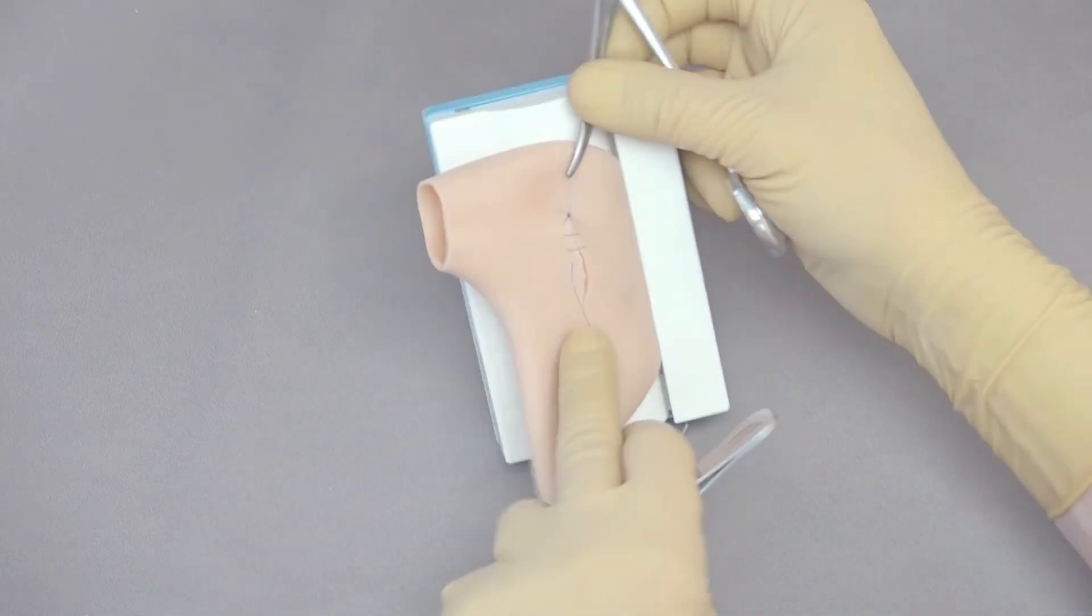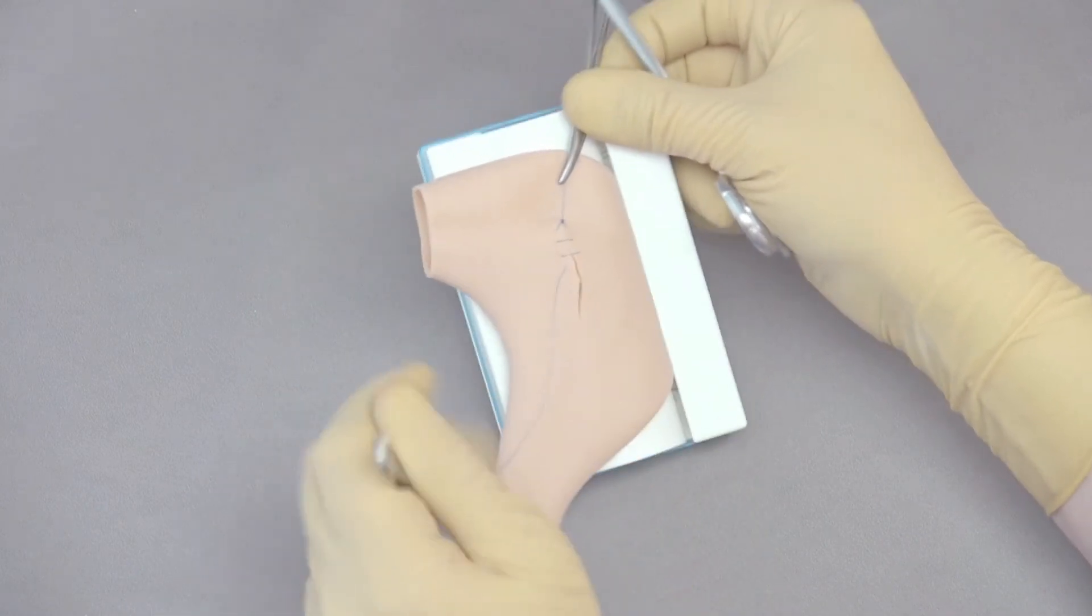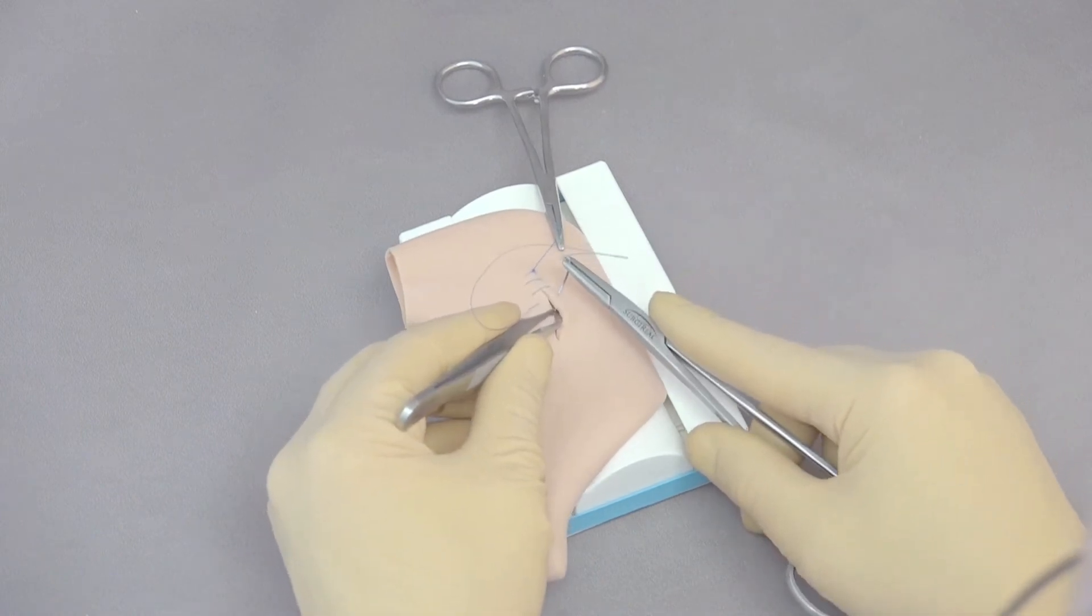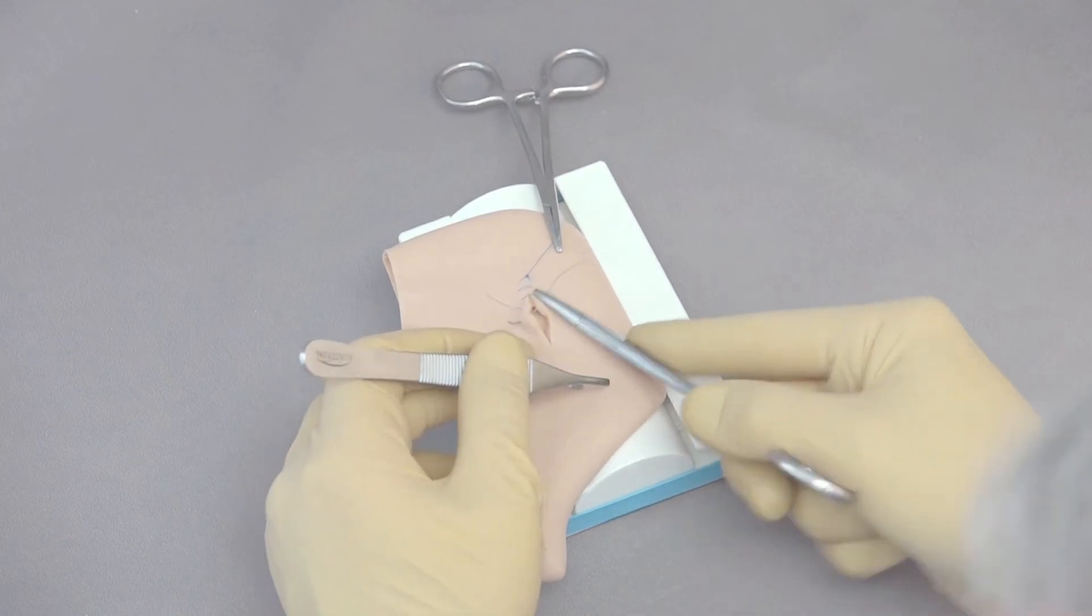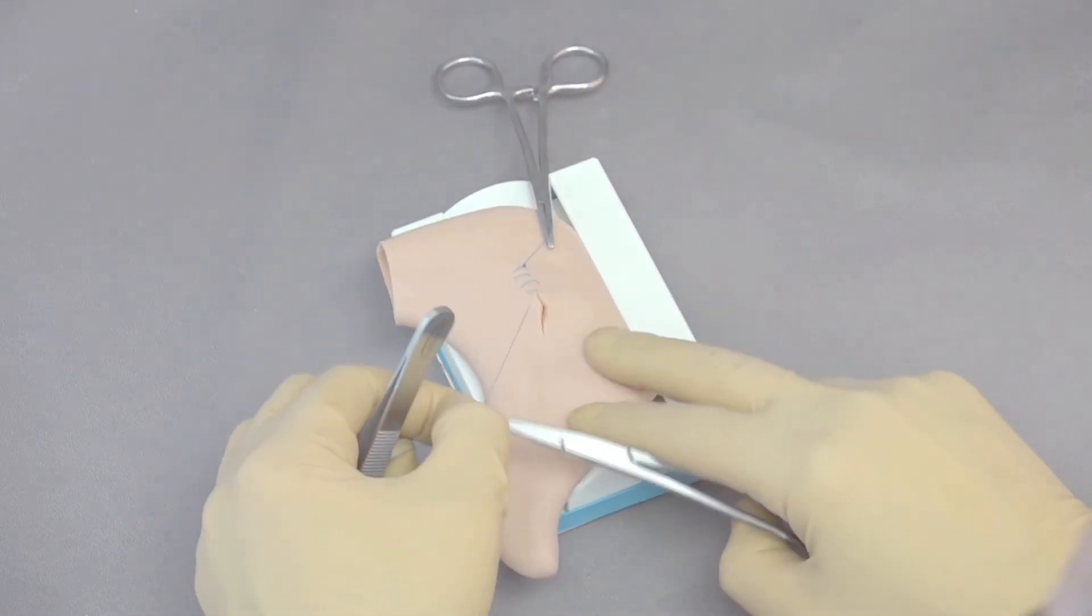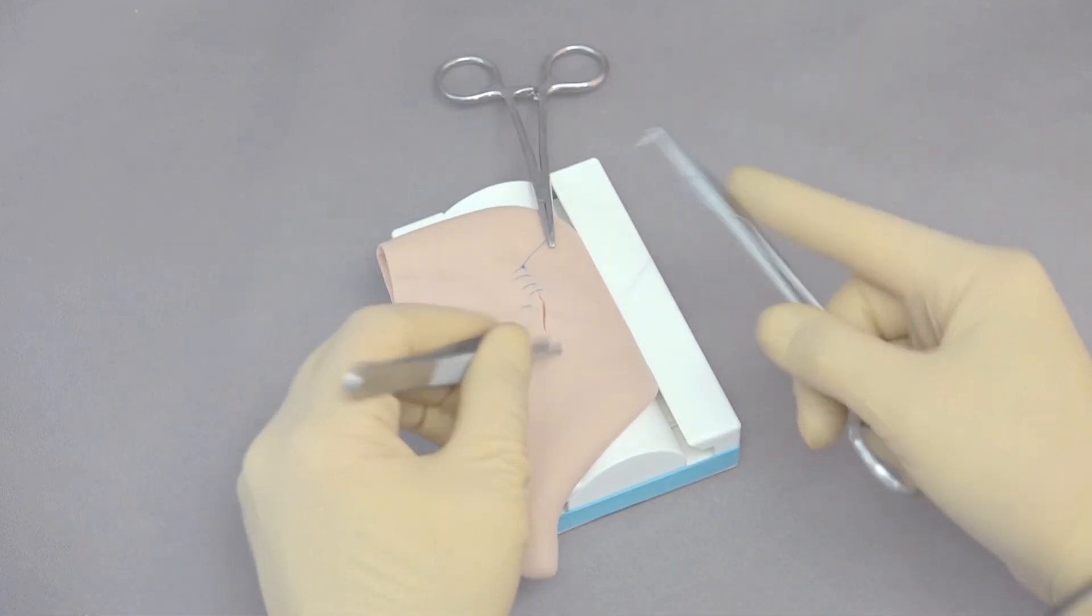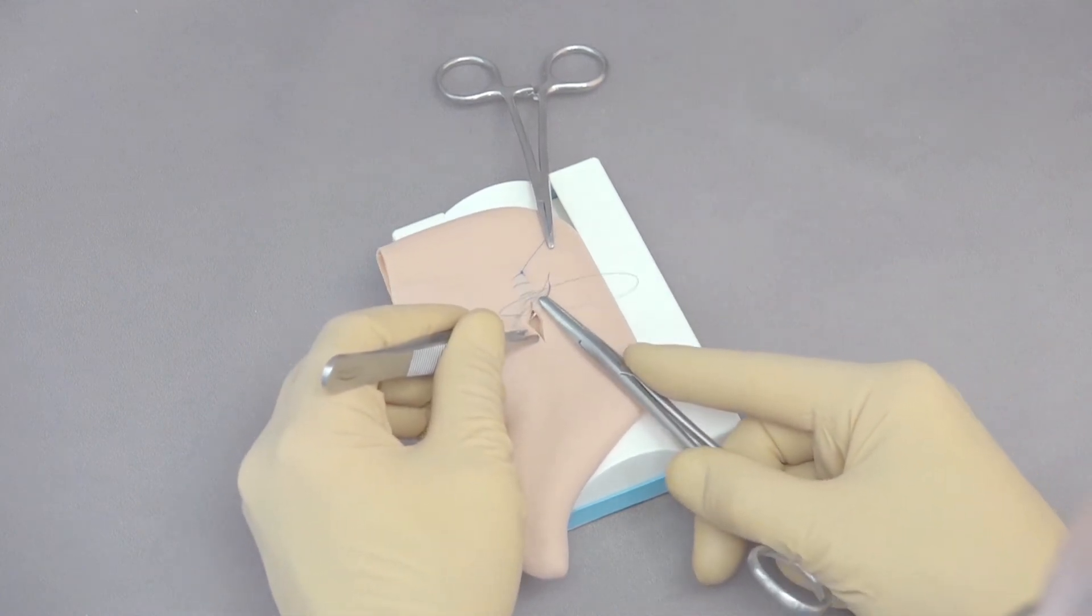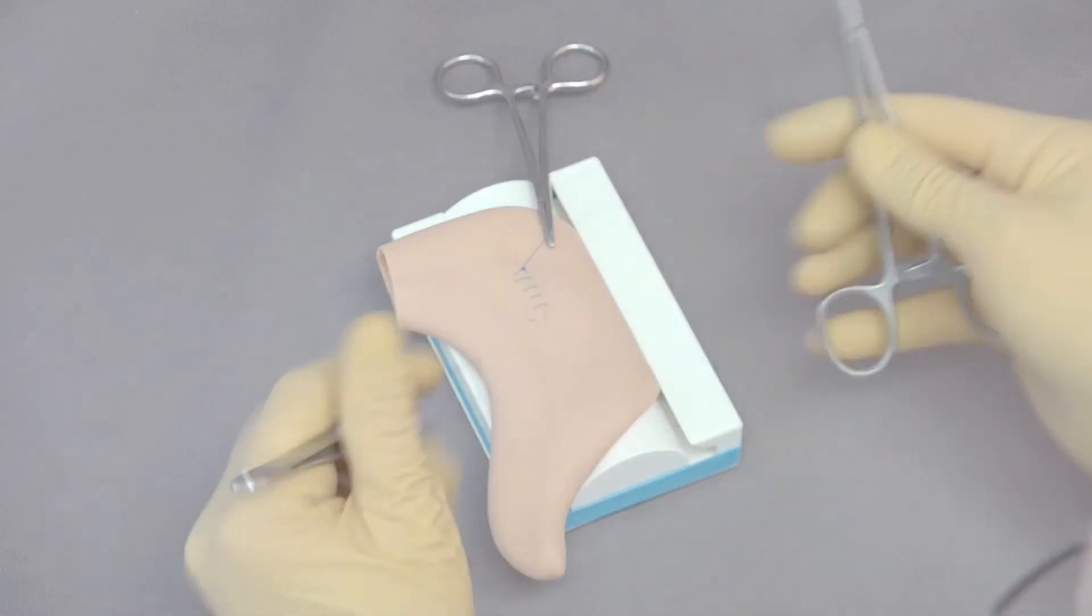The key here, as we make these, is to make sure our suture bites are evenly spaced from away from the incision and along the incision. While this stomach model replicates a stomach, it's really just the concept of doing a hollow organ. So bladder, colon, all of those things can be replicated using this particular model. You can see that the tensioning base makes it really nice to be able to hold all this steady while you're working on your own.